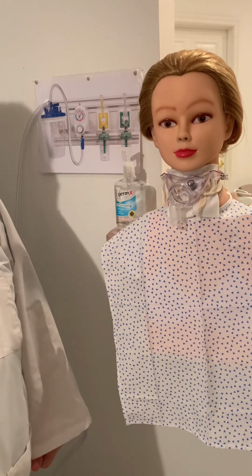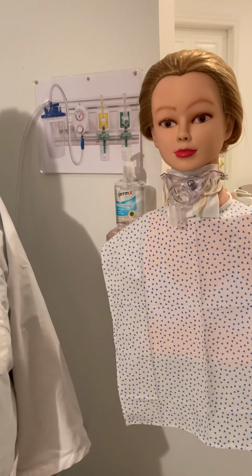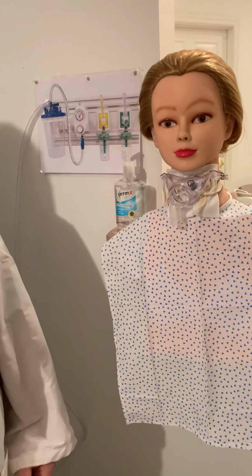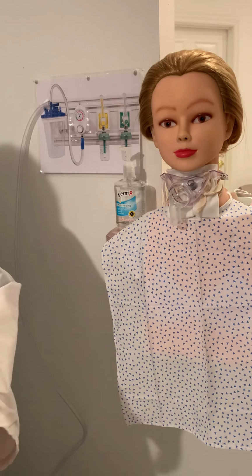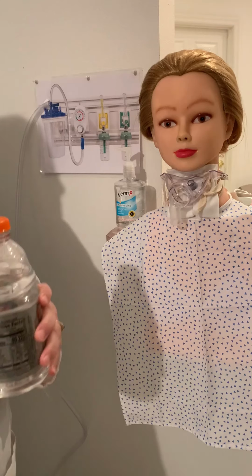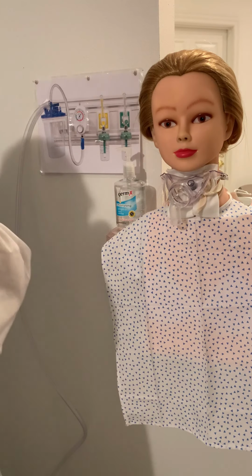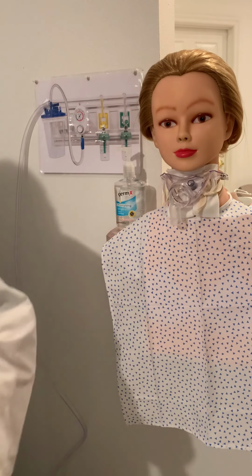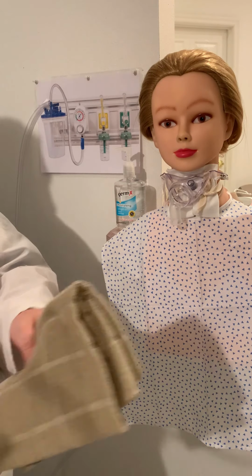Today I'm going to demonstrate how to suction a trach. So the first thing you need to do is gather your supplies. Supplies you need are gloves, some normal saline. I'm going to pretend this is saline. We need our suction catheter, a towel, and our stethoscope.